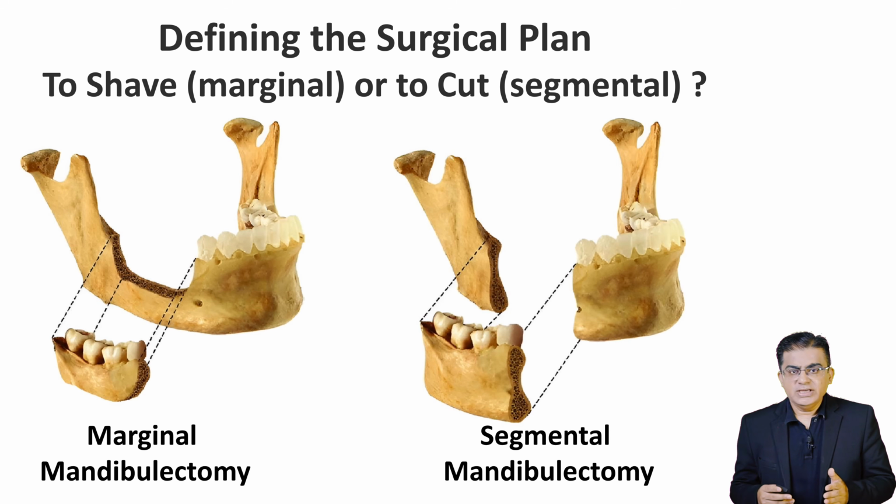And that is exactly why you cannot guess if the bone is involved or not. You cannot just examine the tumor and assume the bone is involved. You need absolute, bulletproof diagnostic clarity about bone involvement before you take the patient to the operation theatre. So how do we get that clarity? Which imaging modality do we actually trust to make this massive surgical decision? CT, MRI, or PET-CT?